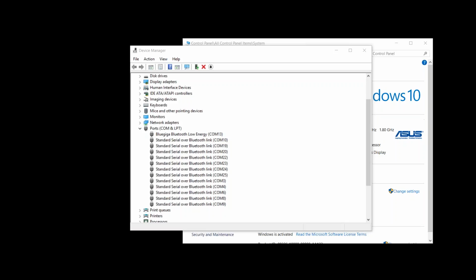Then Tom has asked, are the problem detection zones validated or just guidelines? We have actually material coming for that. I don't think I can actually answer that thoroughly right now, but yes, we have done actually quite a lot of testing regarding the muscle fatigue threshold, and there is definitely a scientific background for that.